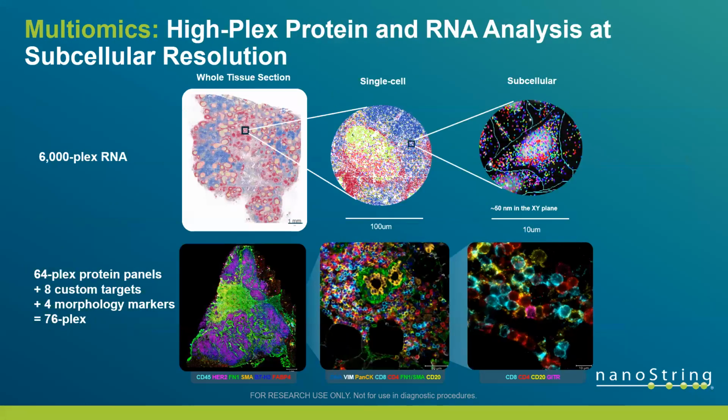It's exciting. So what you're really looking at from the CosMx perspective, again, being able to do something like a serial section, is getting into multiomic analyses, right? At 6,000 plex, being able to look at tissue and understand within what we describe as a field of view, you can then look at the single cells present within that field of view, and then understand the genes that are present within those cells.